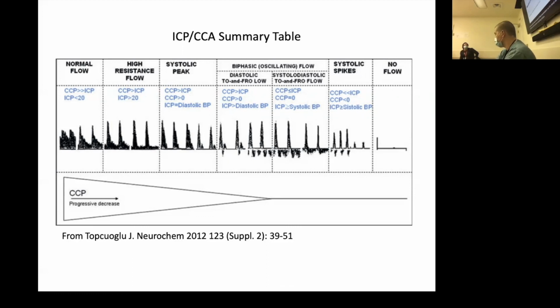From a point of care standpoint, I don't think it's the same threshold as for that exam. I still think it's going to be much more than, say, for lung ultrasound, maybe 10, 20, for example. I still think you probably need to have more exposure. And of course, that's only the MCA territory, not the carotids or vertebrals or ophthalmic.